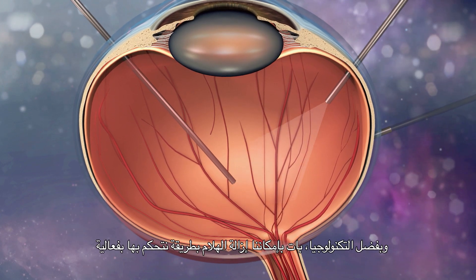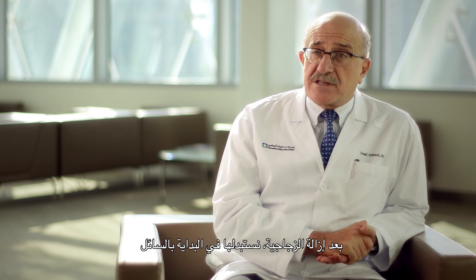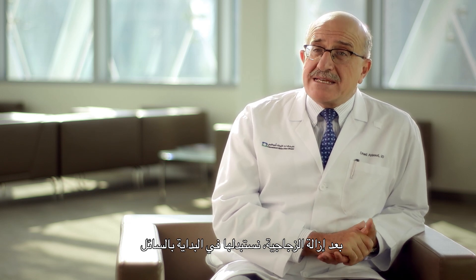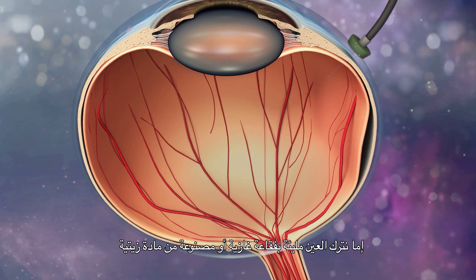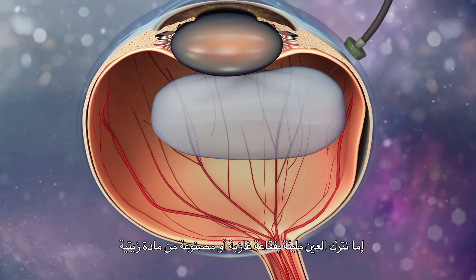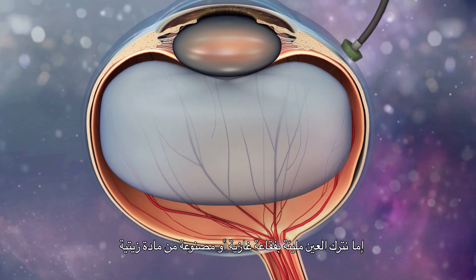The rate of removal is very controlled. Technology is extremely effective in allowing us to control every step of the procedure. After removing the vitreous, we replace it initially with fluid, but then at the end of the procedure, we leave the eye filled with either a gas bubble or an oily substance.